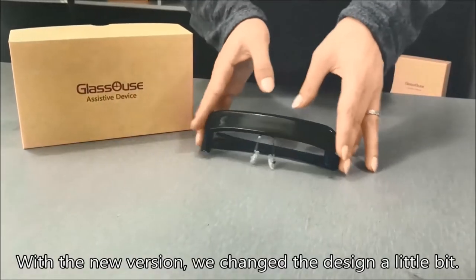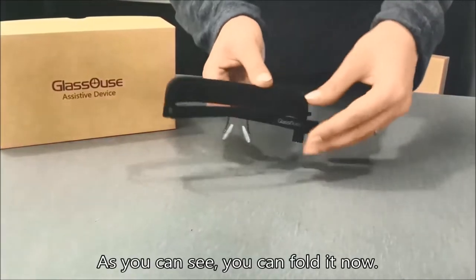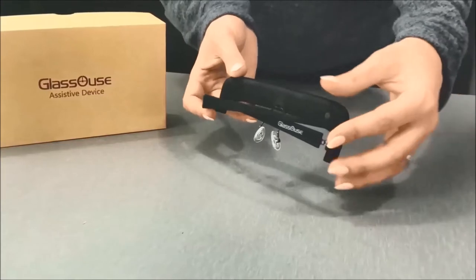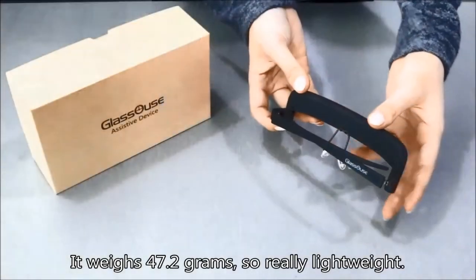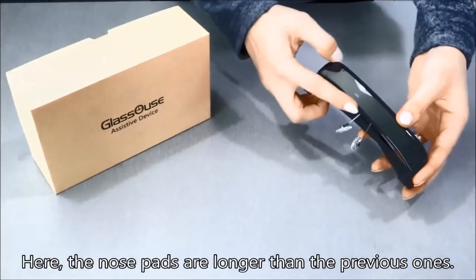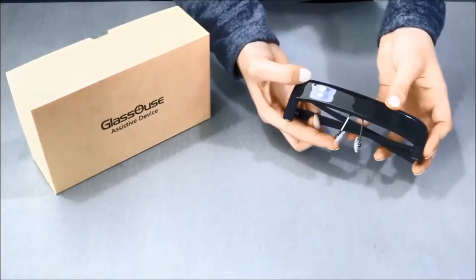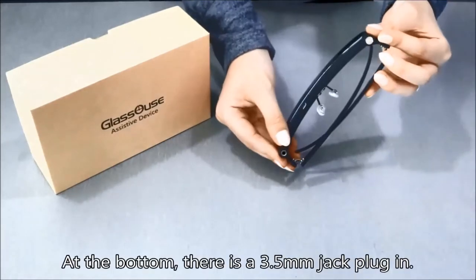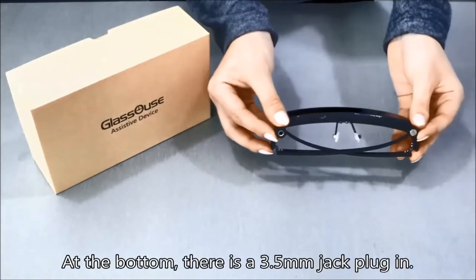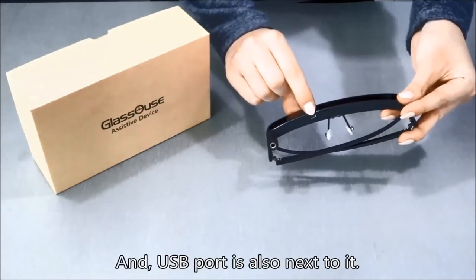With the new version we changed the design a little bit. As you can see, you can fold it now. It weighs 47.2 grams, so it's really lightweight. The nose pads are longer than the previous ones. At the bottom there is a 3.5 mm jack plug-in, and the USB port is also next to it.